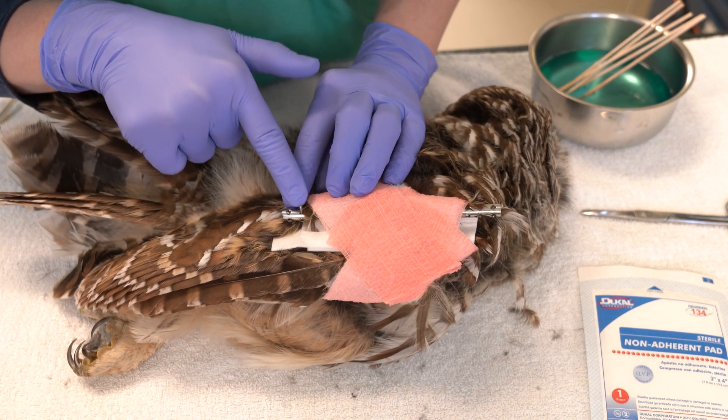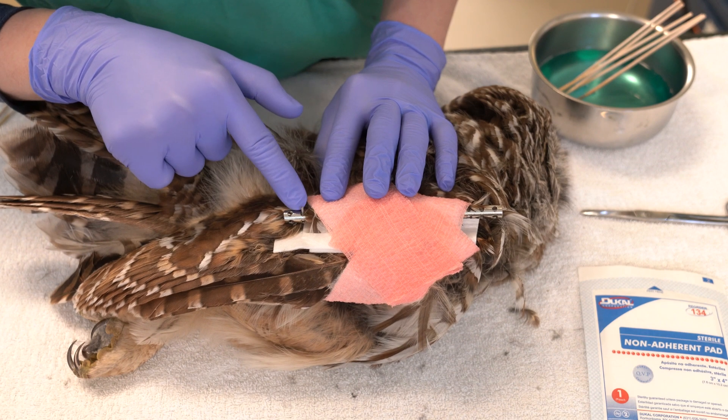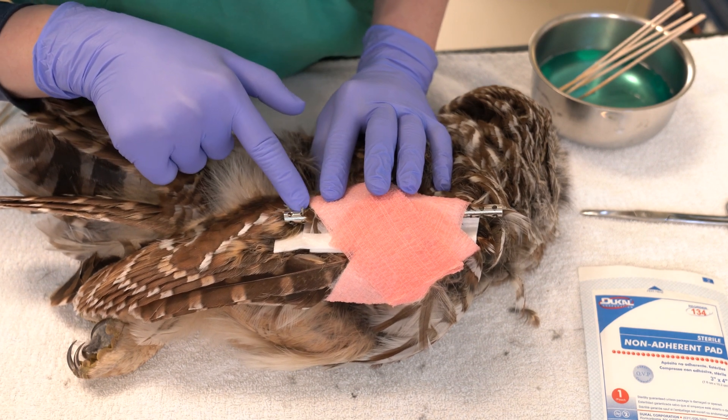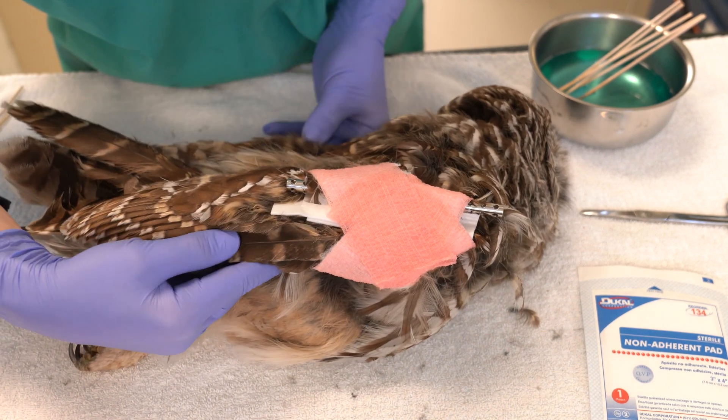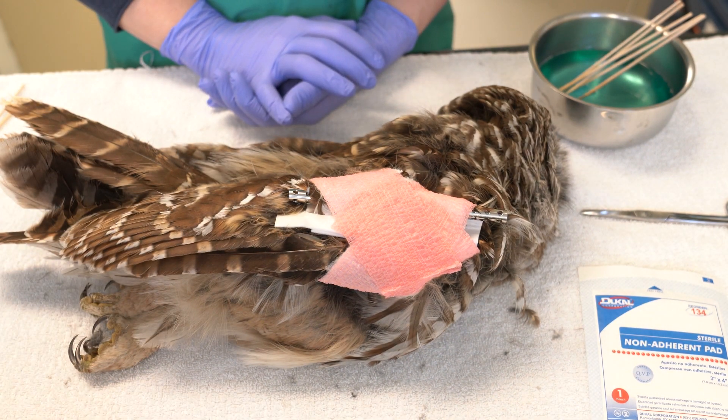You may also want to cover exposed hardware with bandaging material to protect both the handler and the bird from injury. If the fracture includes the humerus, a body wrap should be applied around the body, ensuring it is not pulling too tightly around the sternum.